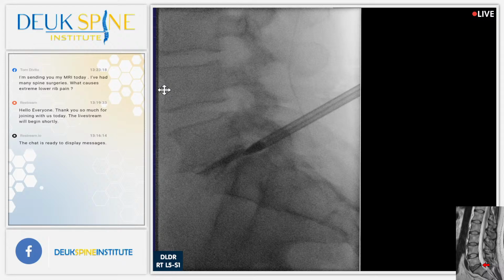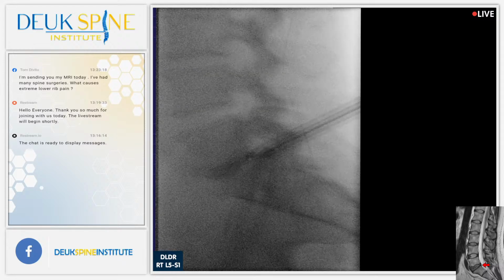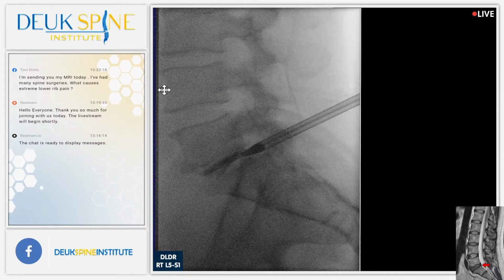His facets are injured as well. So whatever he did to his back, he did to his back and his facets. Take your time. We could start with facets if you want. Let's see. But he's very sensitive, because that disc is painful.